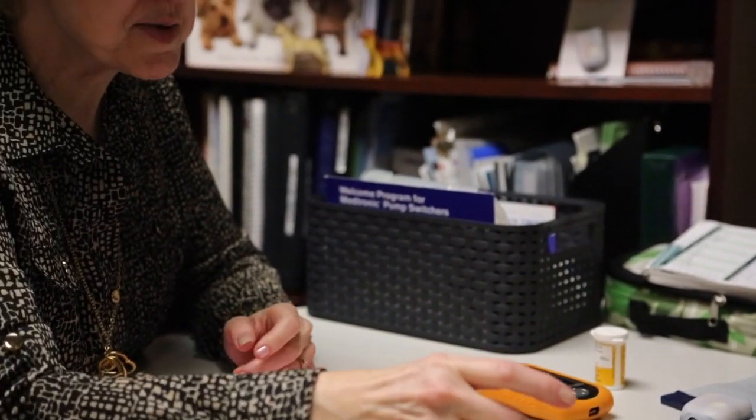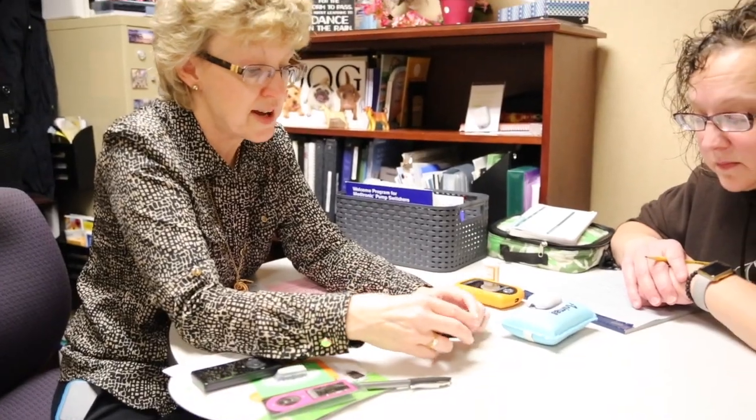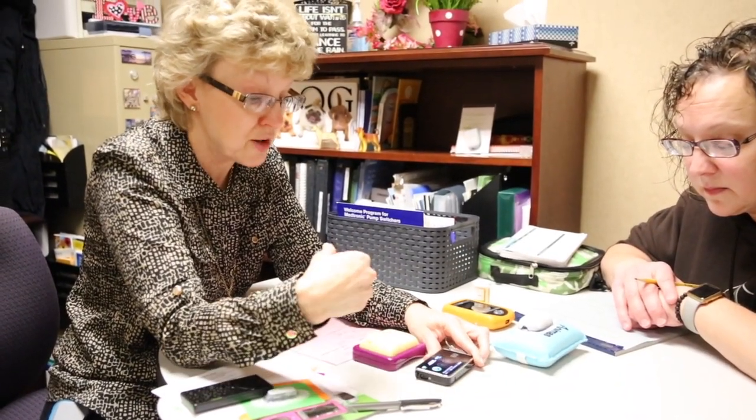Now, with a traditional pump, this happens to be the Tandem pump. These two are our biggest. I've told you about the Tandem. Because we're here and we don't know what's going to happen with this, I just wanted to show you. Got to learn it because you never know. This one takes batteries, I think two triple A's, and they should last a couple weeks. This is a charge unit. So you charge it just like your phone or your tablet. In fact, it's the same charger for my phone and my tablet.